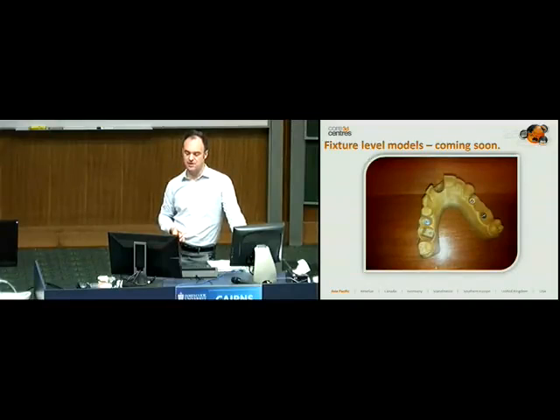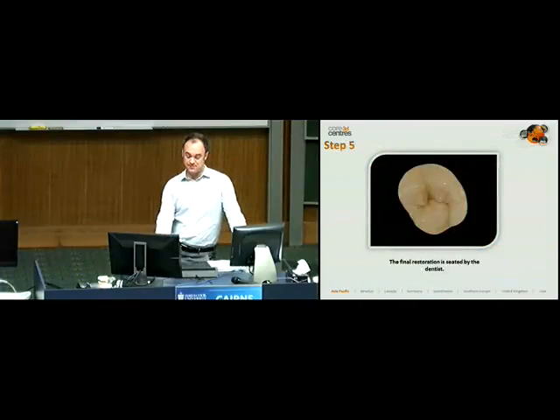So really excited about that, because it would allow, for example, a specialist perhaps on the review of the implant, so 6 to 8 weeks later when the patient's being reviewed, to quickly scan, and the next time you see that patient, you would have an abutment and a crown ready to effectively put into the patient's mouth, which is a very powerful thing, which we're really excited about. And then, of course, the final restoration is seated.